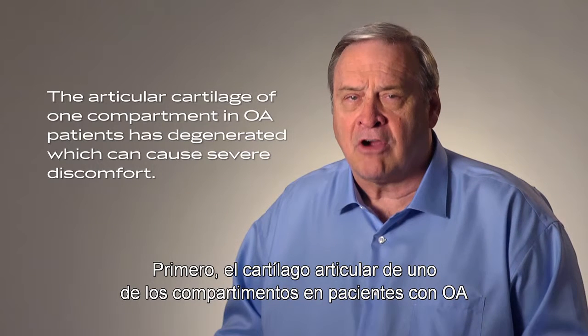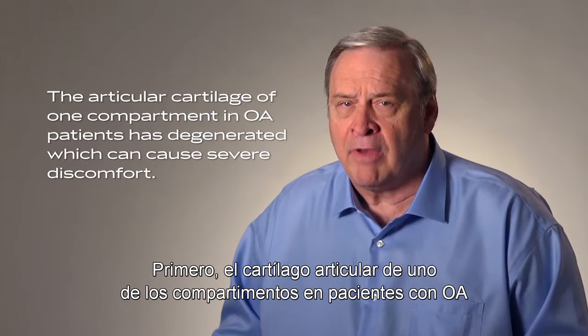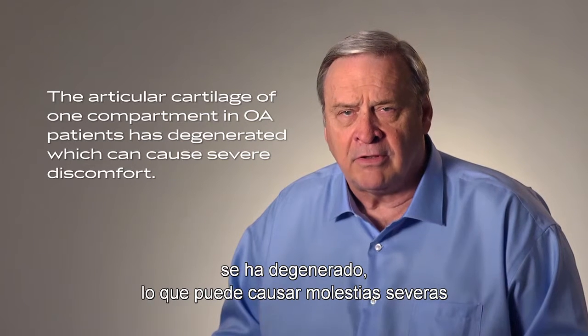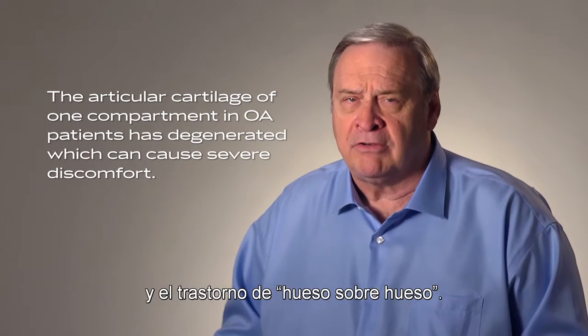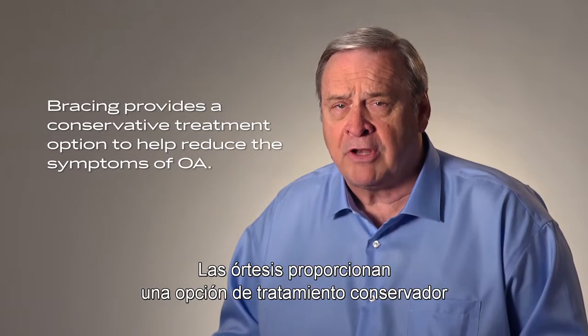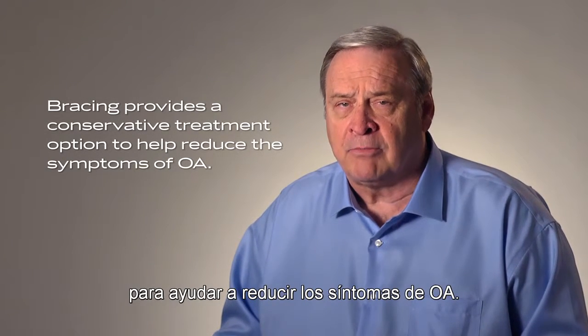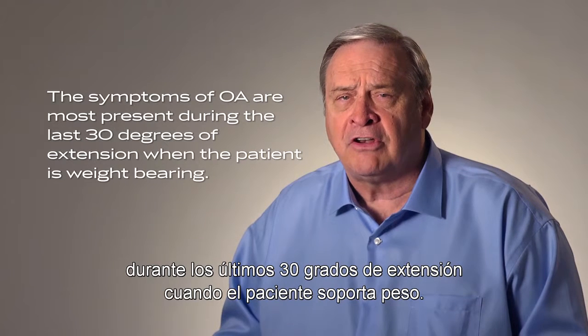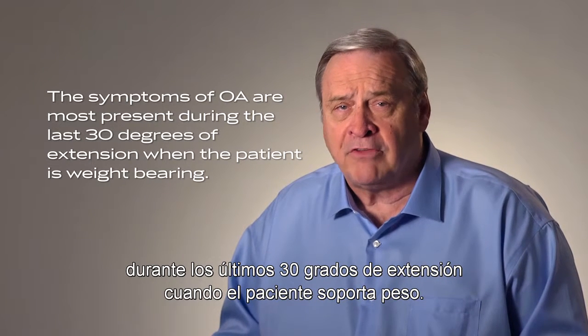First, the articular cartilage of one compartment in OA patients has degenerated, which can cause severe discomfort and what we call a bone-on-bone condition. Bracing provides a conservative treatment option to help reduce the symptoms of OA. The symptoms of OA are most present during the last 30 degrees of extension when the patient is weight-bearing.